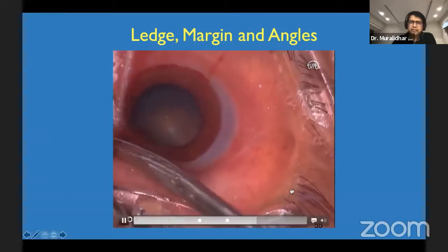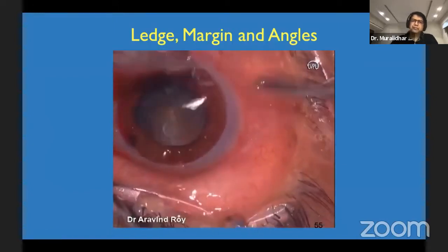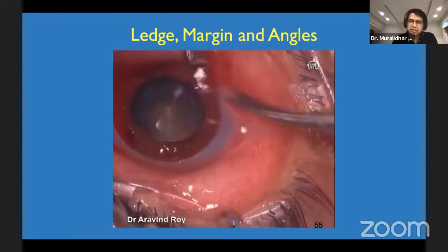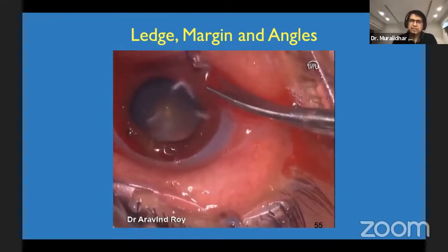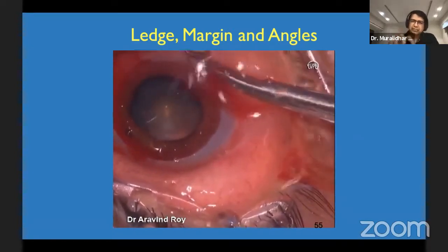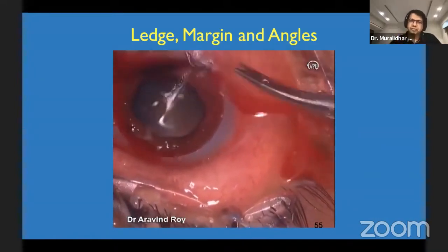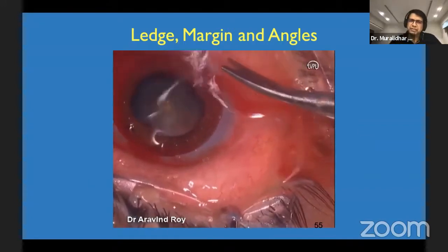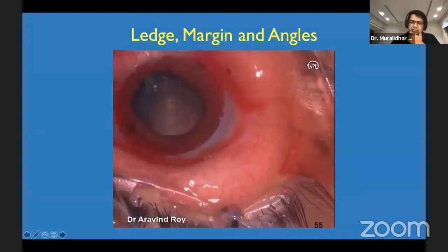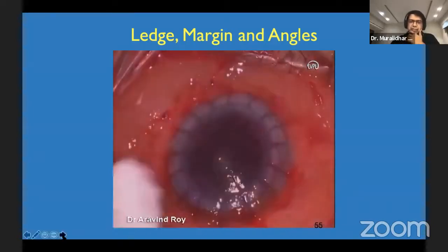And one of the most important things is that we prepare our donor tissue even before opening up the recipient bed, in a certain scenario wherein you have a pre-existing large perforation where you hand fashion. Since you don't know the actual size of the peg you are going to create on the recipient bed, it's very important to prepare the donor tissue in such an instance after completely measuring the defect size you end up making. So that actually minimizes the risk of having a graft-host disparity.